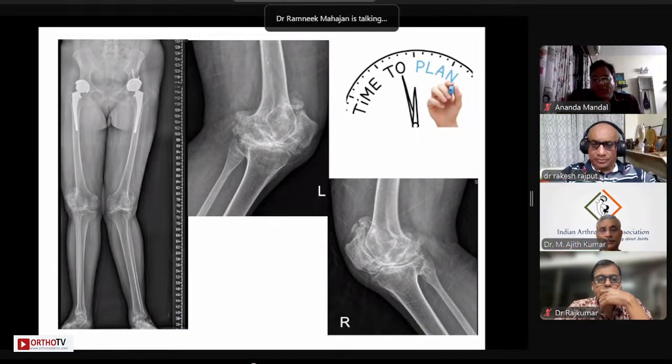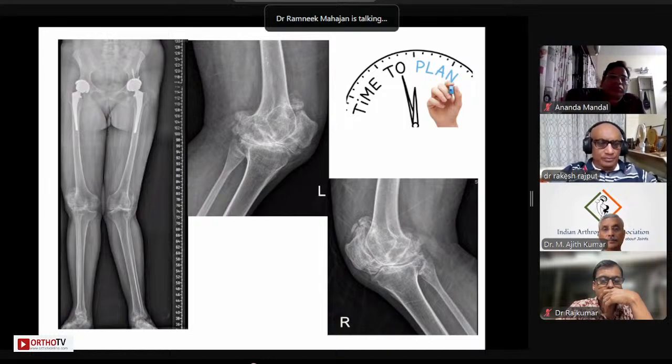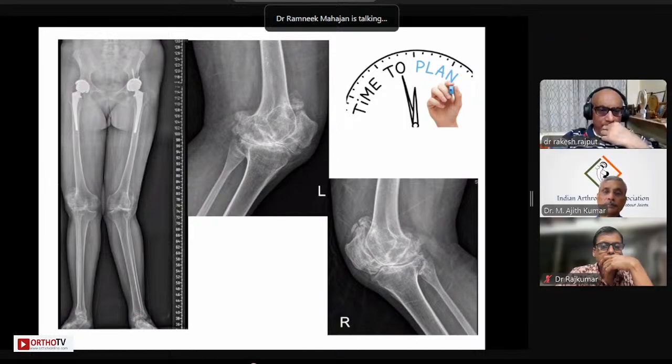So basically, this is where I would say you take a free hand cut, maybe with the tibia, maybe take up an empirical distal cut, and you have some space to work around after you freed your patella. And once you have that, you'll be amazed. You have to basically work around, and then you can get it up. I don't think it would be a major challenge once you have the lateral gutter cleaned up. This is the challenge, the lateral gutter. And once you clean that lateral gutter, this should not be a problem.